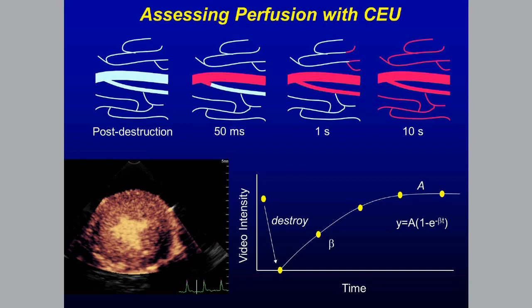Monet? Yeah, we certainly do a lot in our adult congenital. Now, for us, our pediatric cardiology is really just a NICU. We actually have an agreement with our local children's hospital to send anybody between the ages of newborn and 13 over there. And I know that they do not use contrast for looking at the cardiac aspect. Now, of course, there are some agents that have been approved for different uses in the pediatric population, but certainly it's not approved in the cardiac arena yet. But it's interesting that you know of some safety studies. I hadn't heard about that.